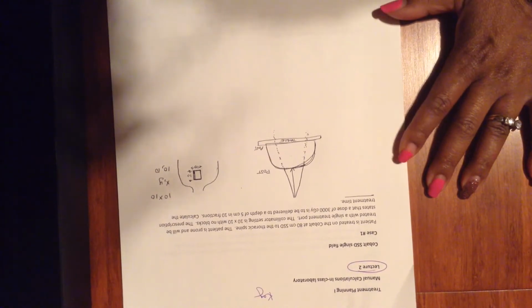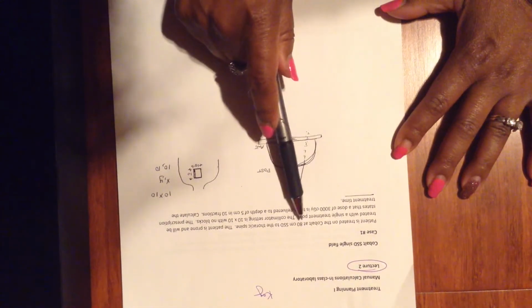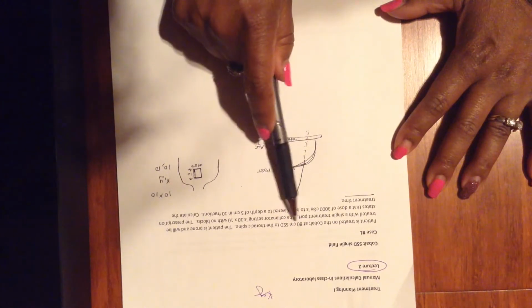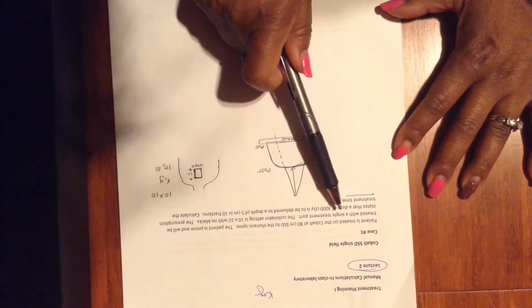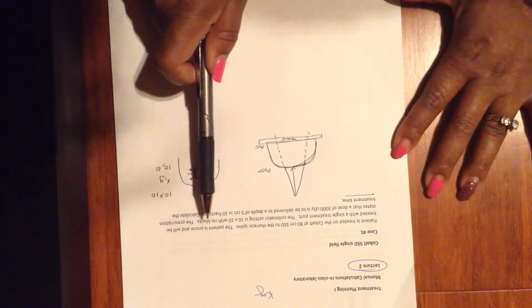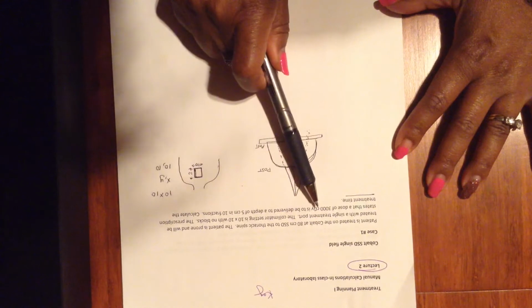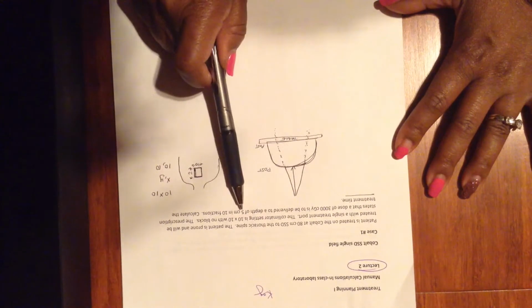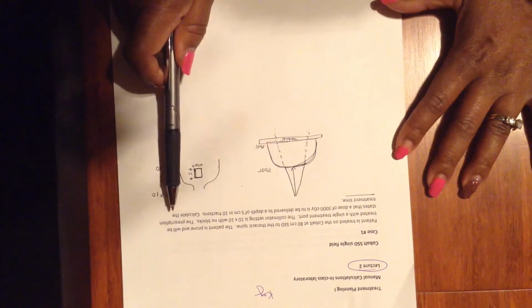In case number 1, we're looking at a patient who's been treated on the Cobalt machine using SSD technique at 80 cm to the thoracic spine, where the patient is prone. We're going to use a single treatment port, and the collimator setting is a 10 by 10, and there are no blocks. The prescription is given as 3,000 centigray, and we're going to deliver that 3,000 to a depth of 5 cm in 10 fractions. The task is to calculate the treatment time.